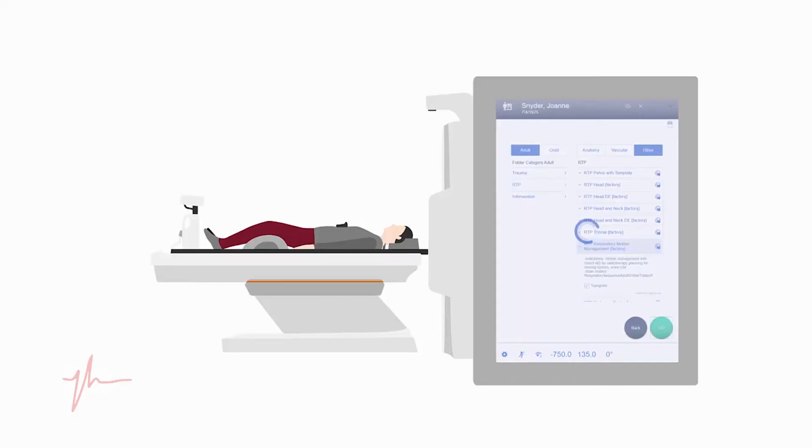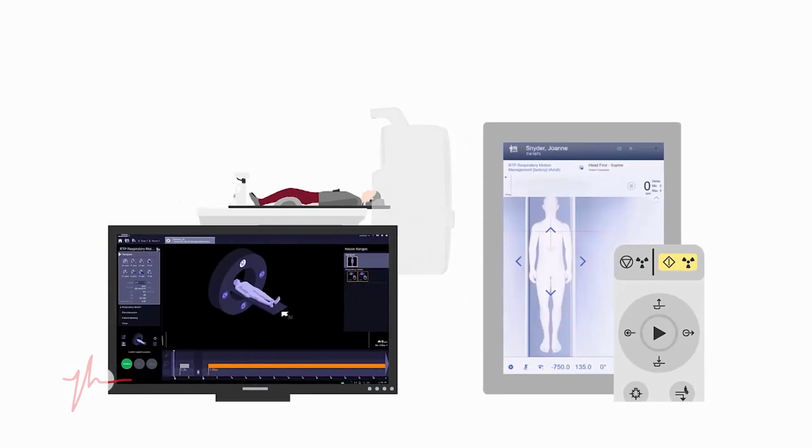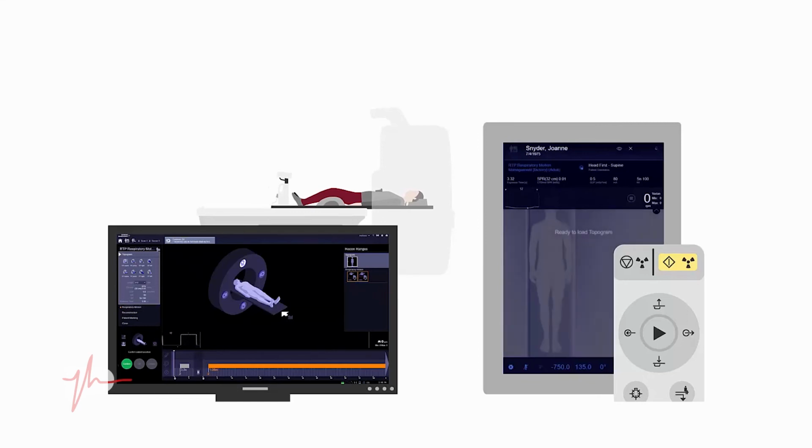For the old system, I understand from talking with you, you actually had to do that afterwards, right? Mm-hmm. With the new scan, the 4D scanner and our CT scanner talk simultaneously. So before, we would have to send it to a third-party computer, let it do its thing on that computer, send it back, and then send it on. So with this new scanner, they talk together, so we're eliminating that third-party computer, and it's decreasing the time the patient's on the table drastically.